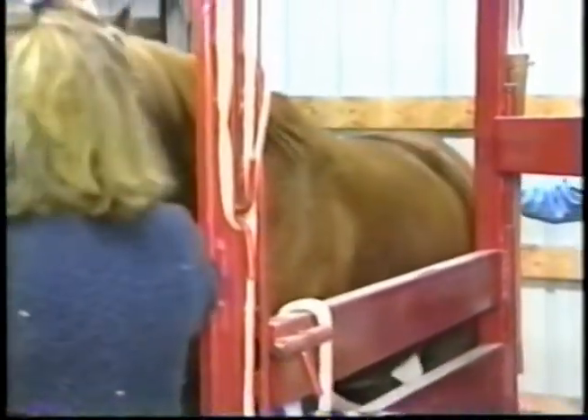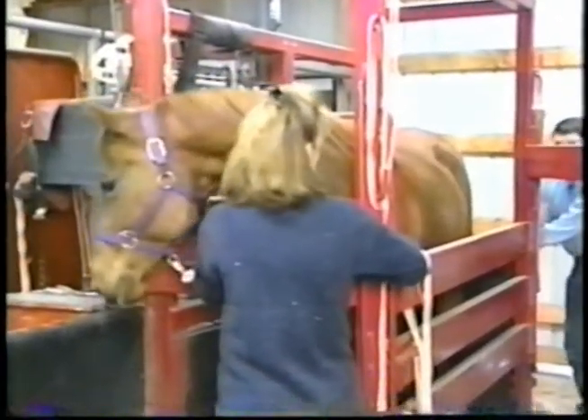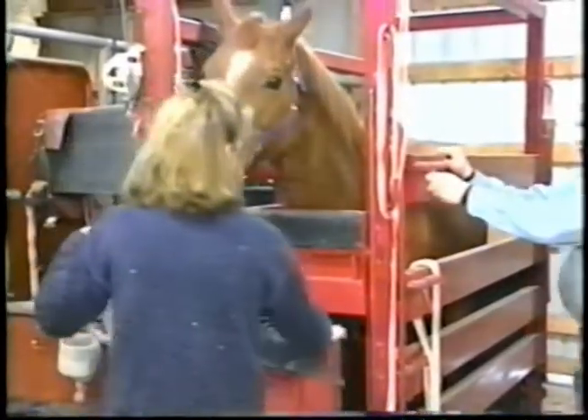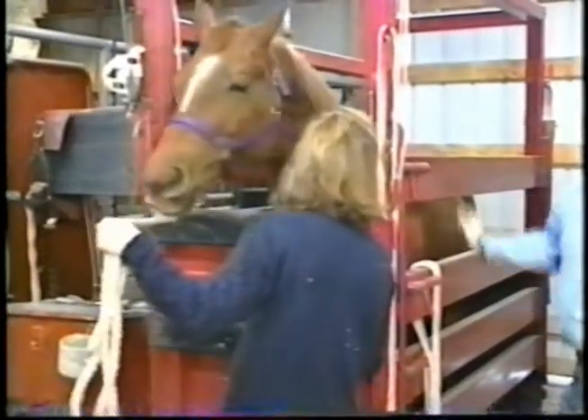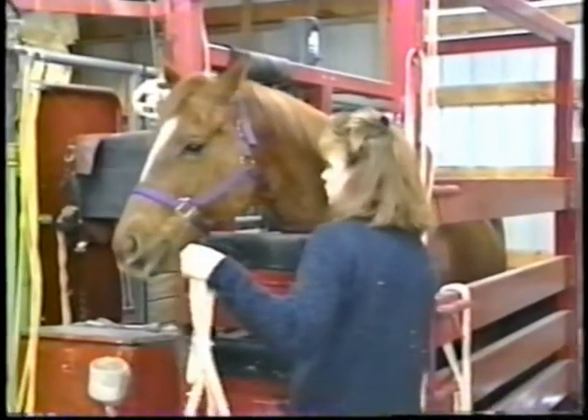We need to have the horse as calm as possible and as immobile as possible. As you'll see in a moment, the quarters are pretty tight at the back of this horse's mouth, and it's very important that we have the horse under sedation for her safety as well as ours.